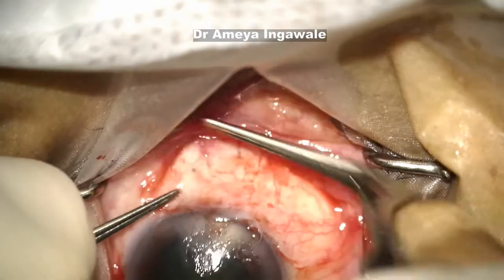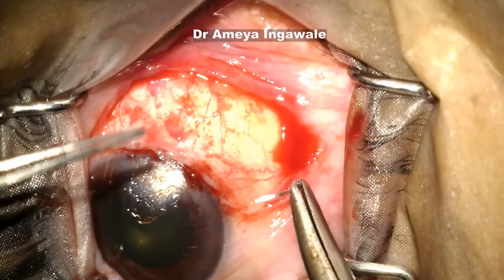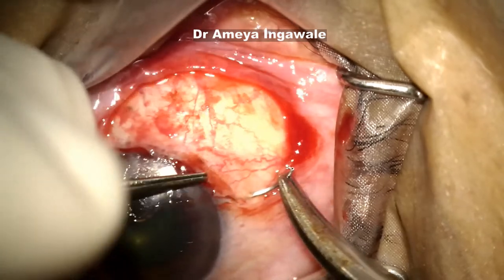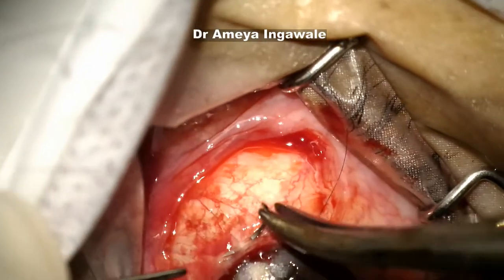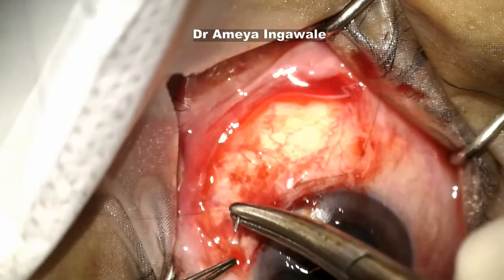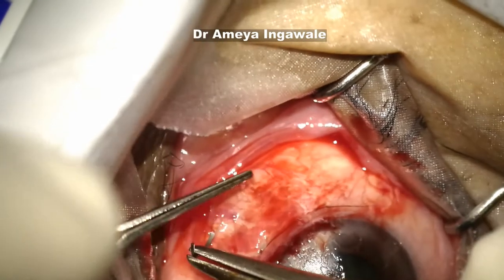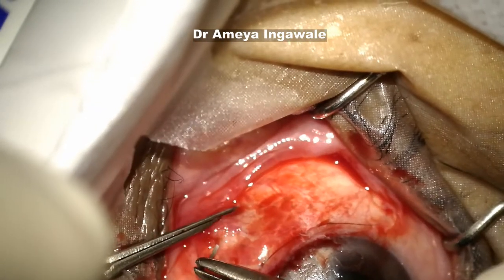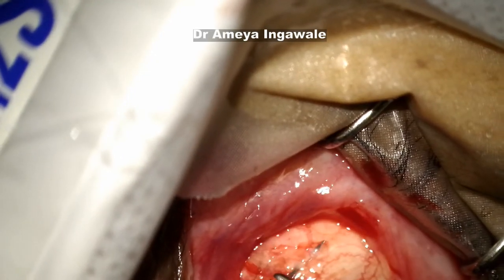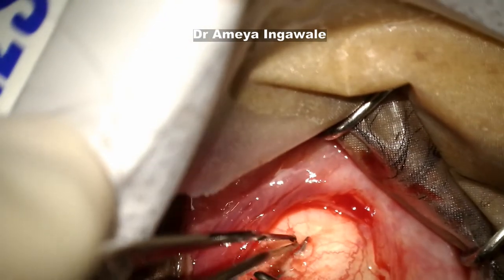What causes recurrence in a pterygium is growth of fibroblasts. If you have good coverage of the bare area, there is less requirement for fibrosis, so fewer fibroblasts come in and chances of recurrence are less. Using Vicryl sutures can also induce inflammation, so I prefer using one single nylon suture in a purse-string sort of configuration — it just presses the graft down and 15 to 20 days after surgery I can remove them.